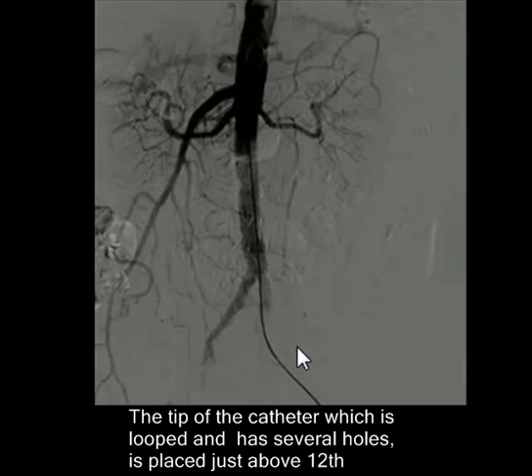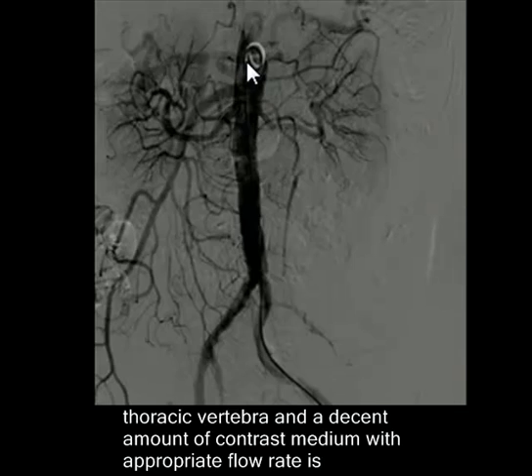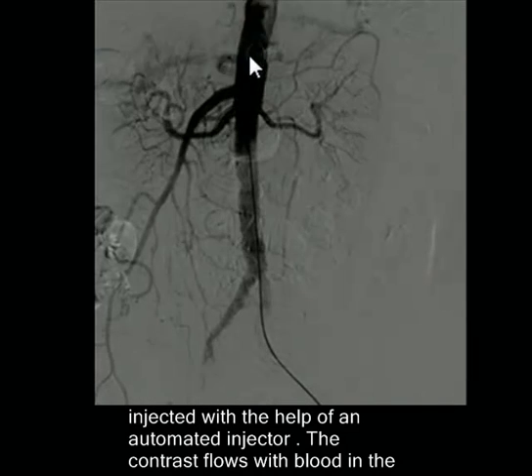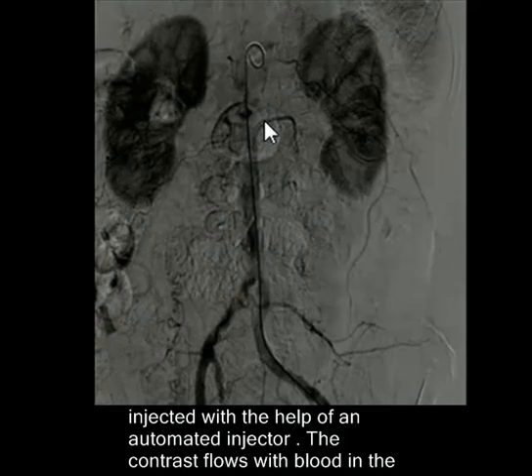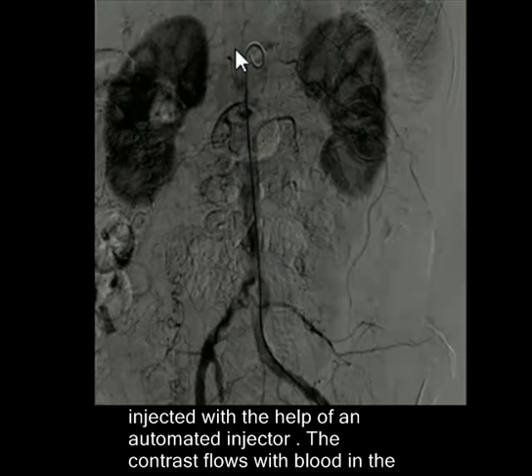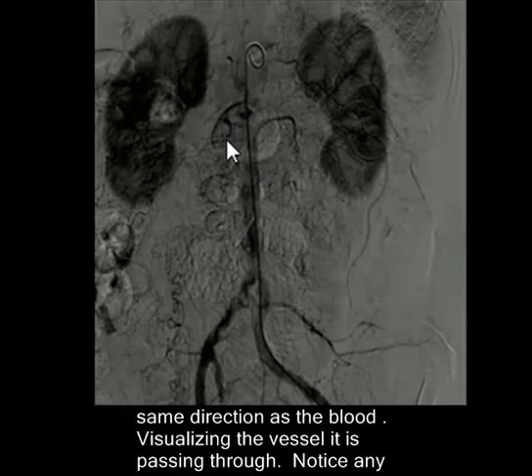The contrast medium is injected — a decent amount — with the help of an automated injector with a decent flow rate. The contrast flows with blood in the same direction as blood is flowing, and as a result the blood vessels become opacified and clearly visible.